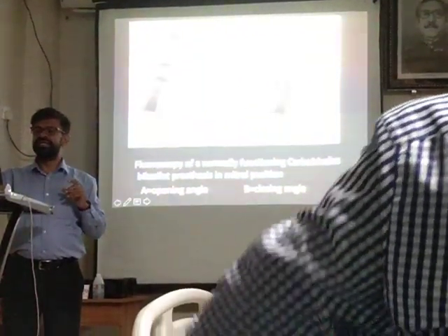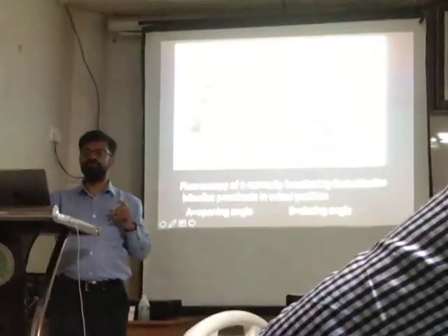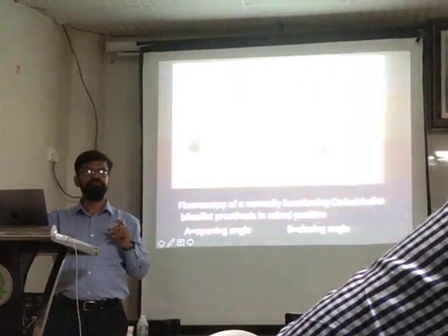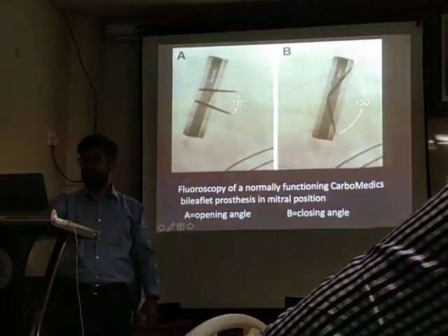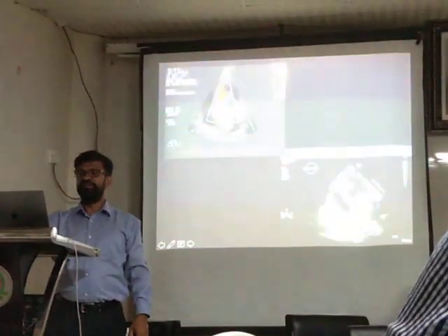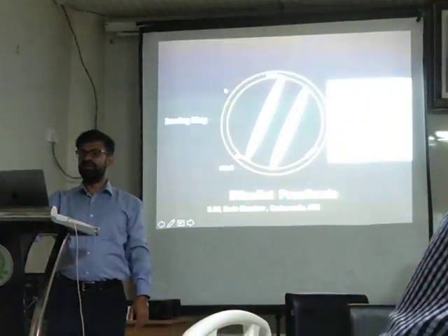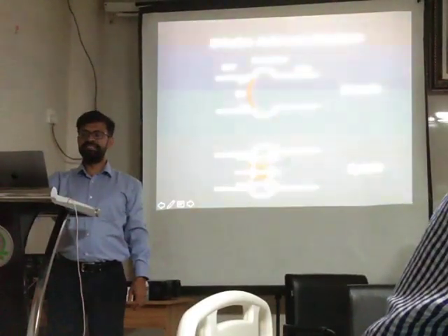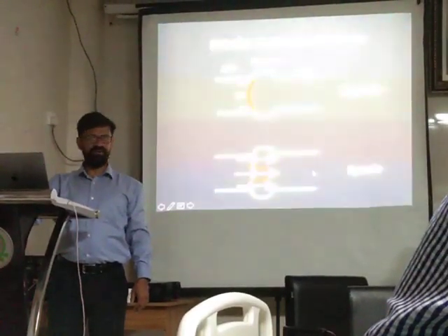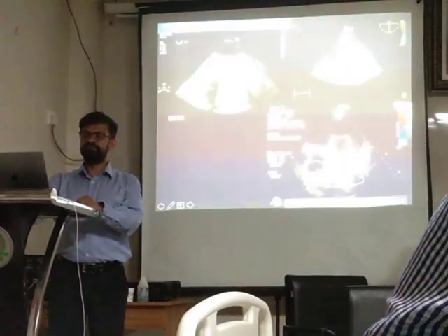So this is the tilting angle. Can you see? This has to be zero, because when the patient is there, they are zero, but this has to open up. Fluoroscopy will tell. It will give you two jets. Then coming to the bileaflet, it will give you three jets, because they form the central jet and lateral two jets. You can get three jets.